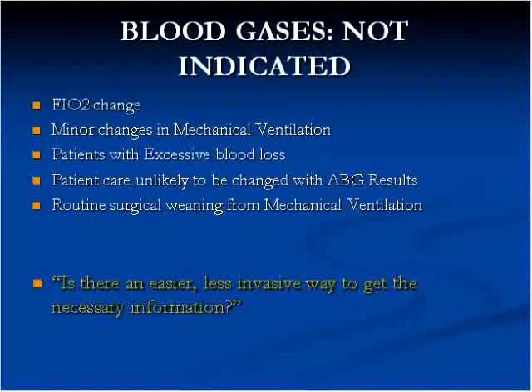When are blood gases not indicated? In my opinion, and in the research that I've been able to do, I'm old enough that we used to do blood gases for every FiO2 change on a mechanical ventilator. We would change the FiO2 10%, and then we would do blood gases in an hour. Certainly with the advent of pulse oximetry, that does not seem to be a very good use of a blood gas. There I would think the dangers are much greater than the additional information.